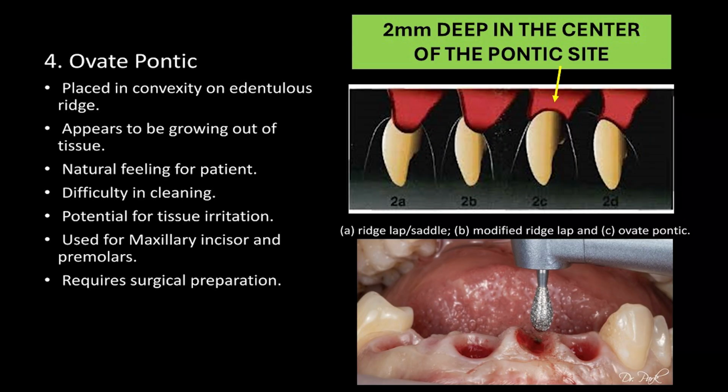See these little white lines right here? This is a simulation of dental floss. So here's the floss, and it has to get clear up under this Pontic to clean it. And most of the time people can't do that. The floss will tear, or they don't get the whole surface clean. This is easy to clean, as you can see.